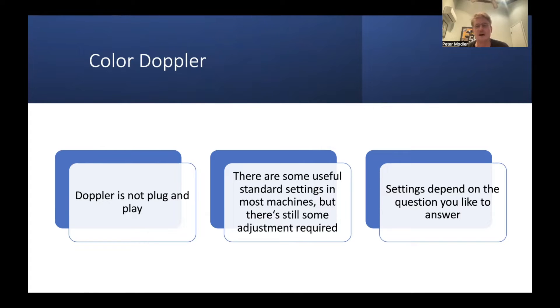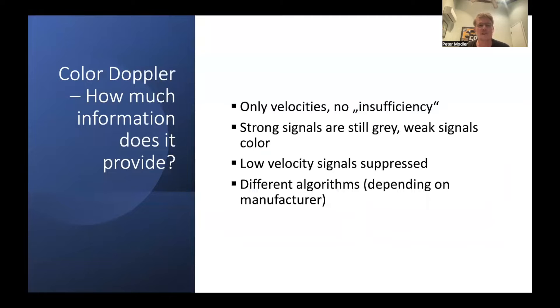I want to show you how to adjust the Doppler settings so you can see your optimal mitral valve jet. It's important to know that Doppler shows you velocities, not valvular insufficiency — it shows the velocity of blood cells. Strong signals on your machine are displayed in gray; weak signals like blood are displayed in color. Every machine tries to suppress low-velocity signals on your color Doppler, but this suppression depends on your manufacturer and uses a different algorithm in each machine.